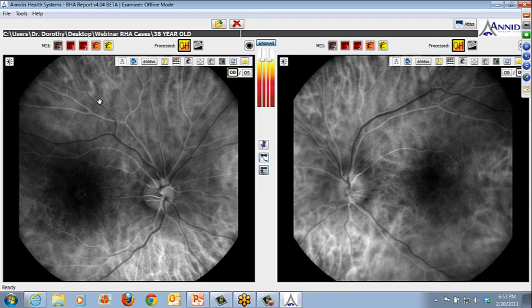This is also a nice example here, because I've had a lot of questions reading the POI about arterial flow and also venous flow. Depending on what moment the image is captured, deoxygenated blood flows through the veins, and of course oxygenated blood through the arteries.